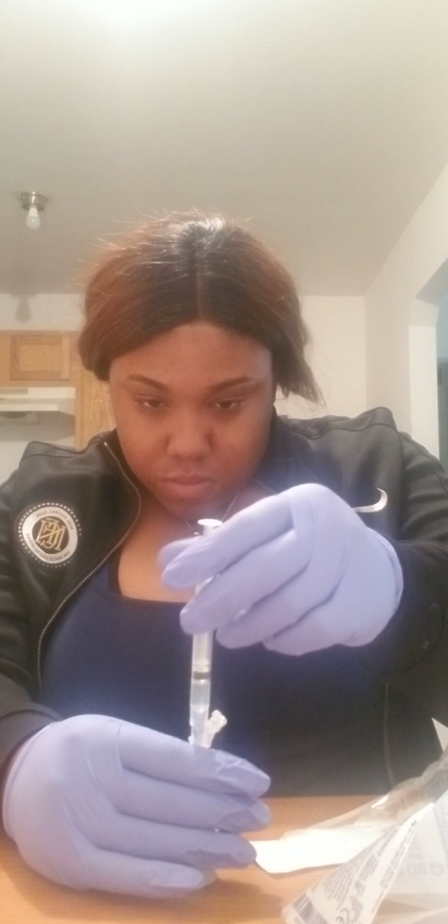I have my alcohol wipes to clean the needle and the site, and I have my gloves. The first thing I'm going to teach you all is an ID injection, which is a 15 degree angle, which is this. Now we have 90 and we have 45.